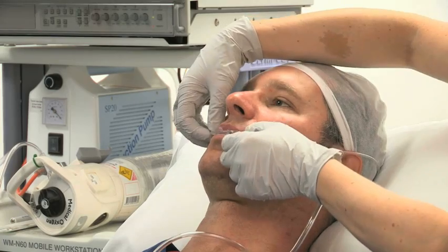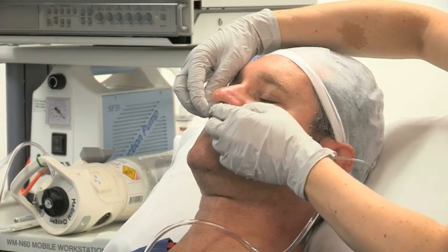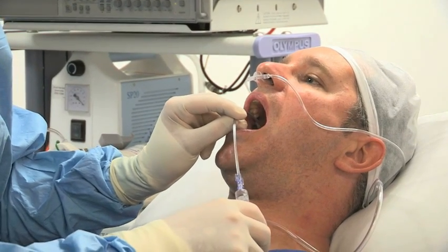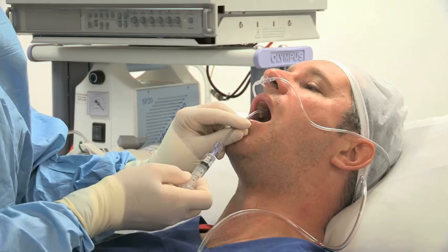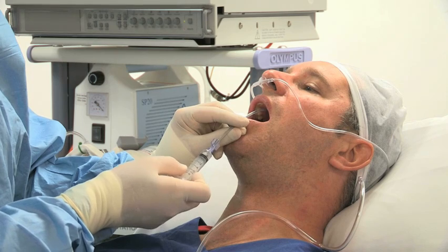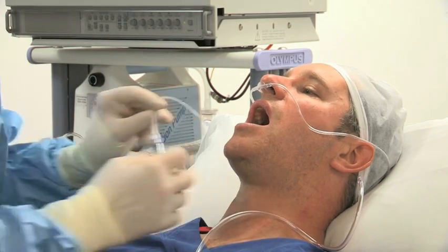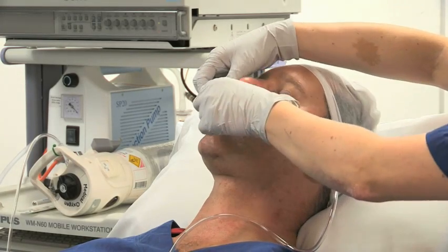Swap the nasal prongs to the nose before oral topicalisation of the back of the throat. Again, using an atomizer, spray both tonsillar pillars and then the posterior pharyngeal wall. And finally, direct the atomizer downwards to spray towards the cords. Return the oxygen prongs to the mouth.